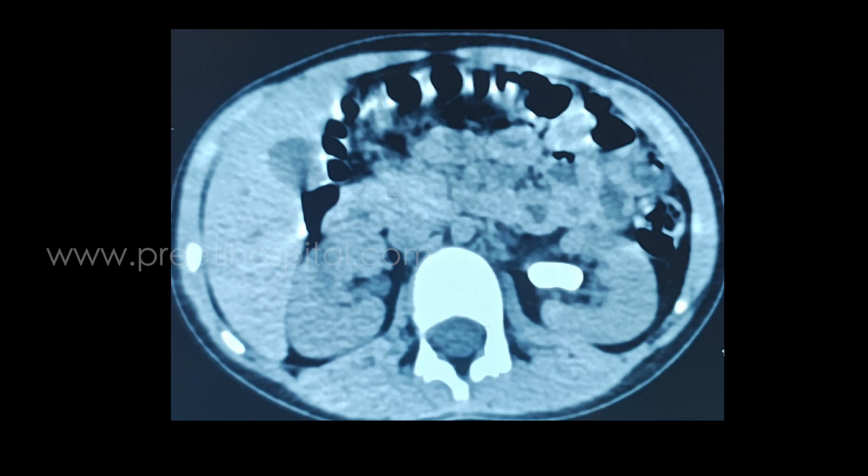Supine PCNL dilatation in children is very difficult because of the elastic, tough nature of the abdominal wall. You always have to use the hand as the opposing force. The rest of the procedure is the same as in adults.